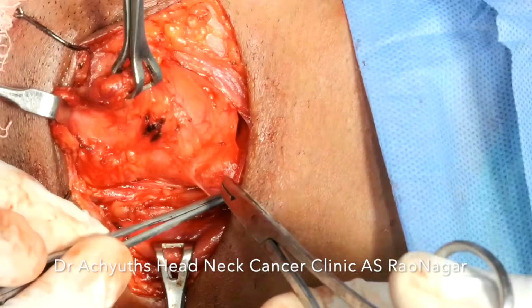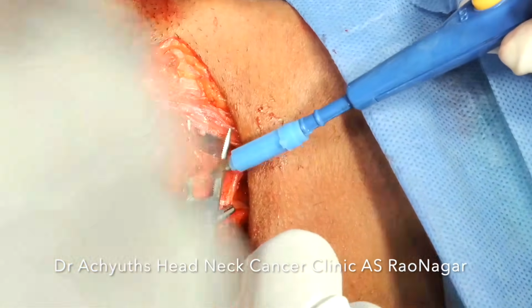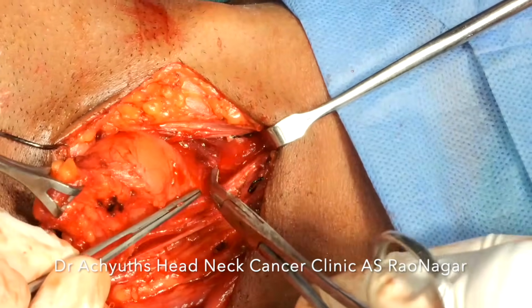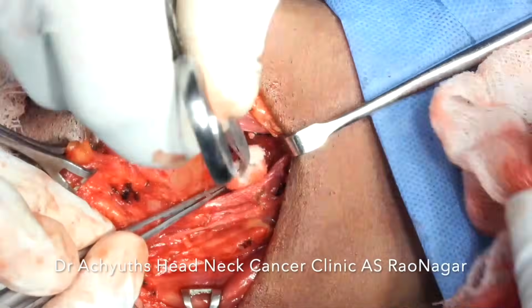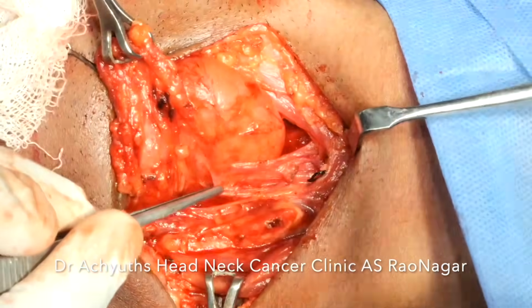This surgery is also important in the sense that the assistant should be very good, because if the assistant with the cautery overshoots and touches the wall of the cyst, then the whole purpose of this cyst excision will be defeated.